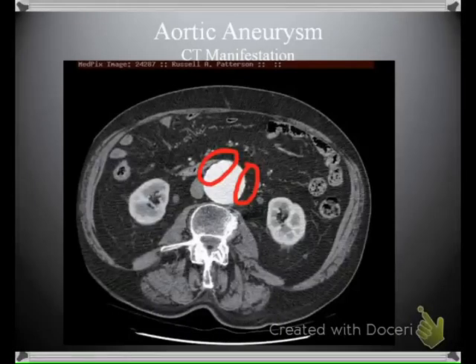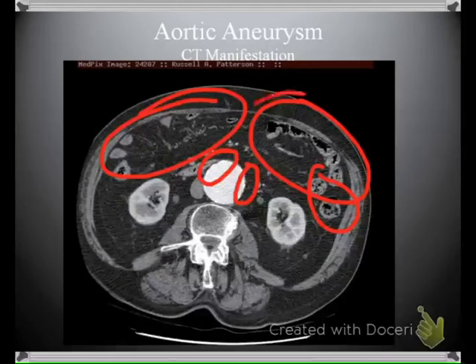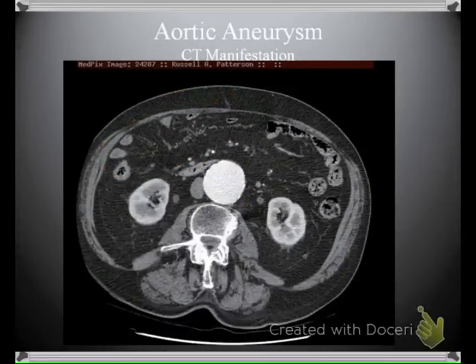And if we were to look at the bowel contents here and here, and even through here, we would see that it'd be very difficult for routine ultrasound to actually acquire these images, and echocardiogram would not be entirely applicable here, and so it would be very much needful that CT be performed. And so we can see the CT does an excellent job in this.